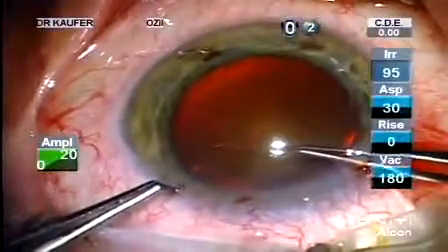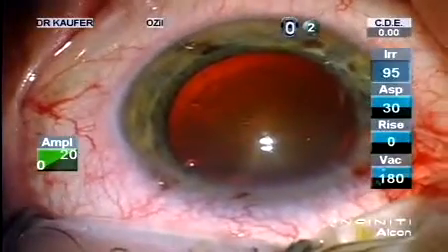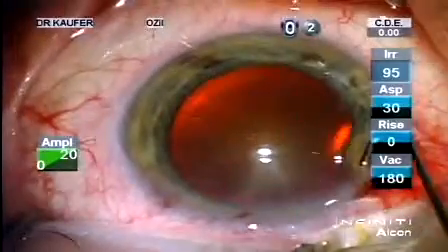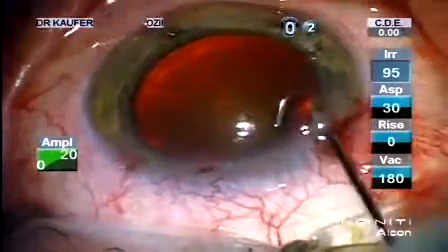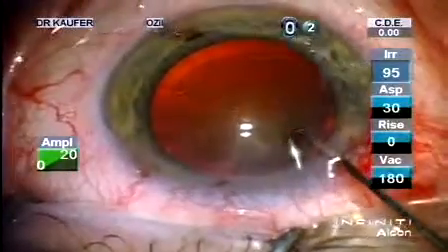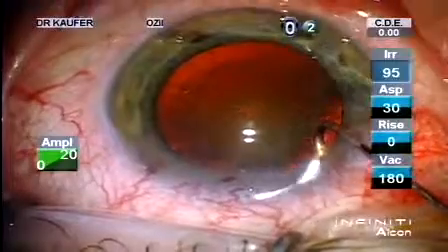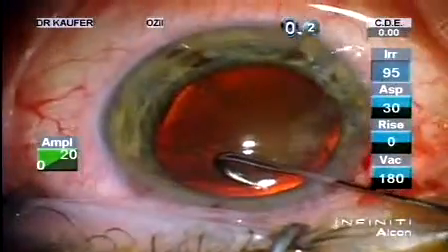One of the great things about microcoaxial is the fact that you can keep the same instruments you were using before, the same Utrata, the same forceps, everything that you used before. You really do not need anything. Through that 2.2 incision, you're able to really do all the maneuvers you were used to before.